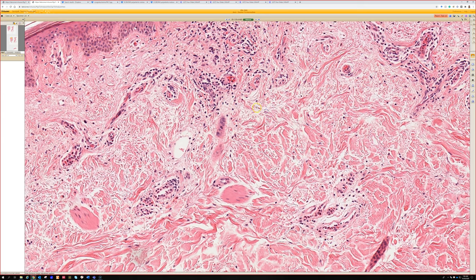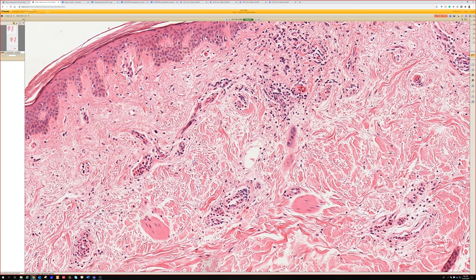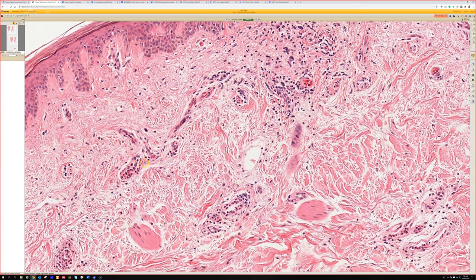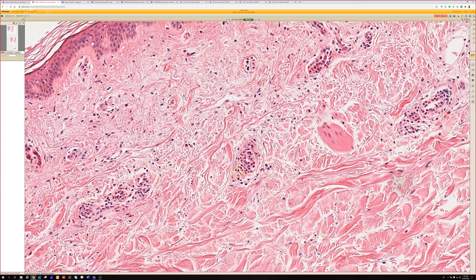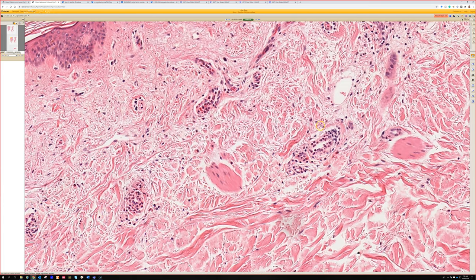So what do you think this is probably classified as? We were thinking urticaria — still looking like normal skin, with lymphocytes and eosinophils around the vessel. Urticaria — that would be great. Scattered, usually sparse infiltrate. There's edema and sparse inflammation. It's usually a mixture of neutrophils, eos, and lymphocytes and sometimes scattered mast cells. They can be like around the vessel. Neutrophils in the vessel lumen, kind of collecting there, is a really nice clue — you don't always see it though.